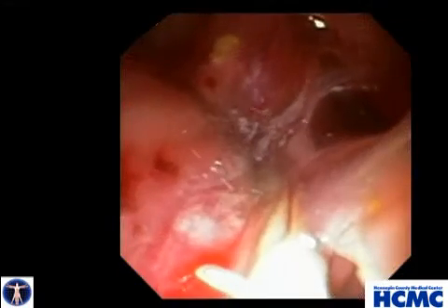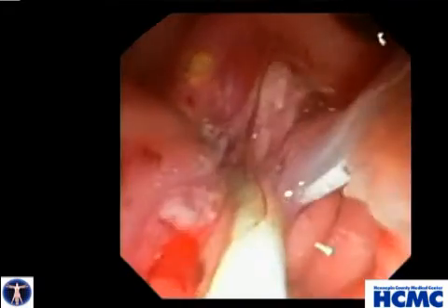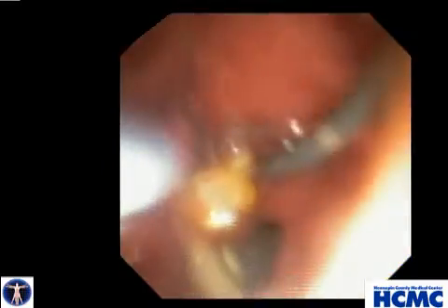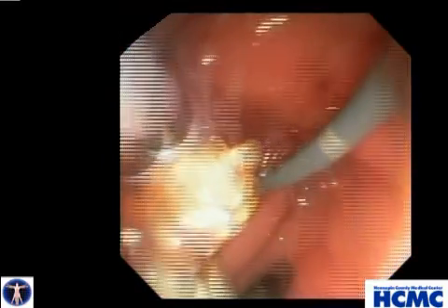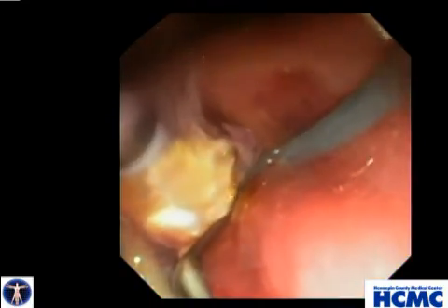Notice the drainage of cloudy pancreatic juice, and here seen fluoroscopically deploying the stent through the stump into the cyst cavity. Then we enter the cyst gastrostomy tract beside the 10 French stents placed a month ago and lavage the cyst cavity, and you can see some rather nasty looking solid debris. We then remove these stents, redilate the cyst gastrostomy, and place 2 new double pigtail stents.